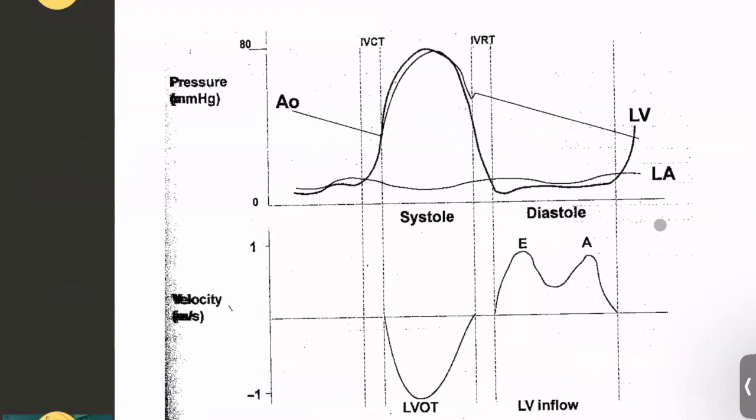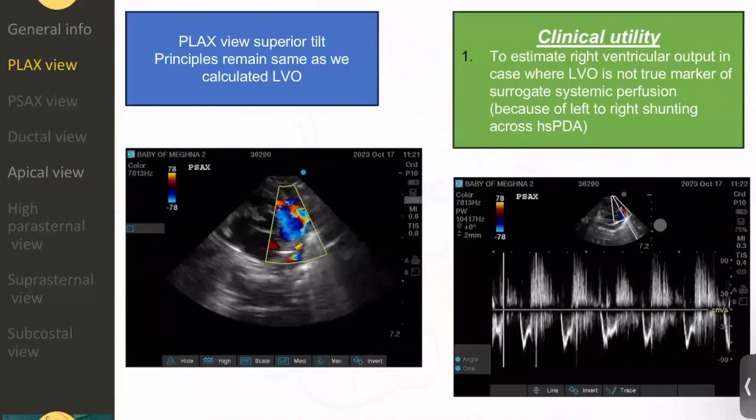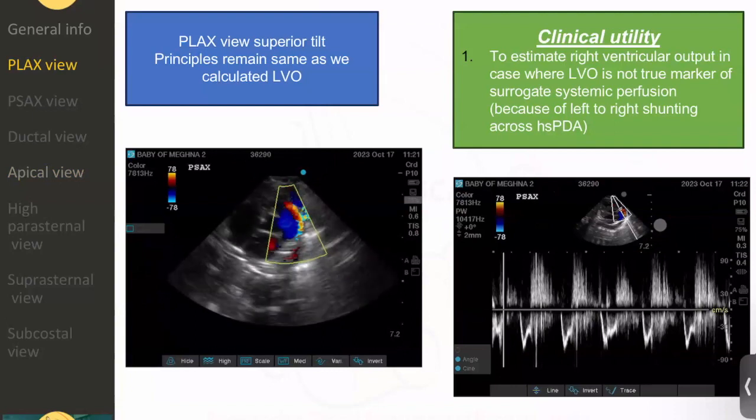E by A wave and IVRT I will leave for the end of the presentation if we have time, because this is a little bit more physics. So give me some time and I will explain it. I will come to it if we have time, because I want to go to the other part.